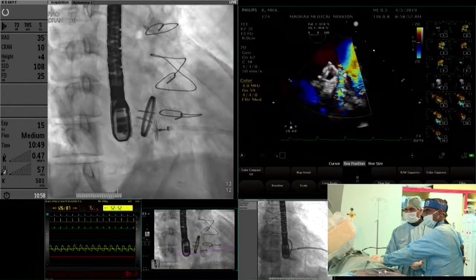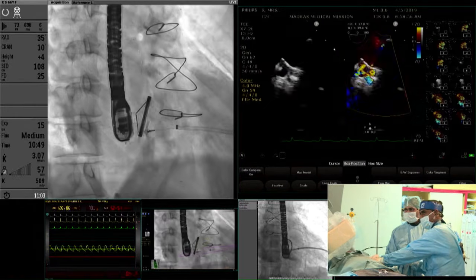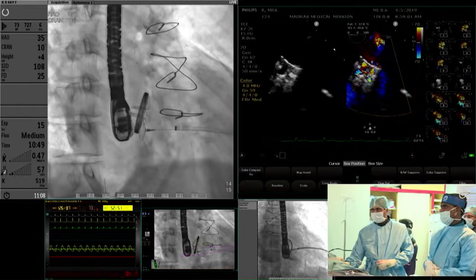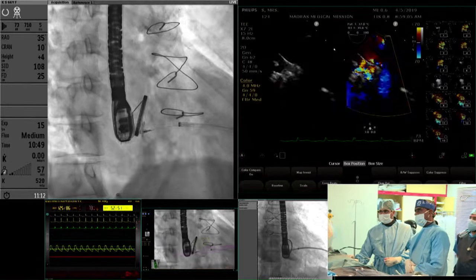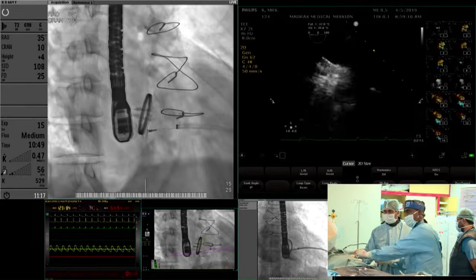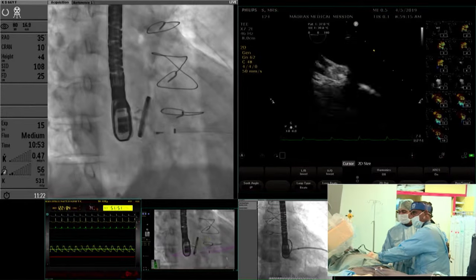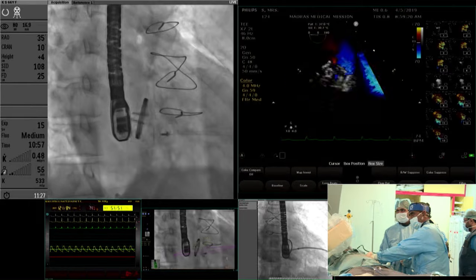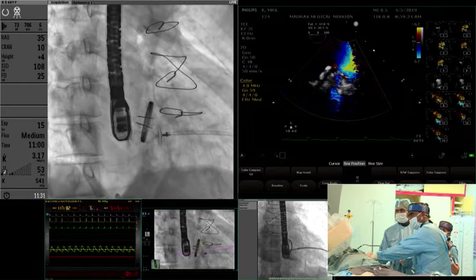Now, the position looks satisfactory for me. No, actually it is slipping out. Even if it slips out, Srija, if the leak has settled to 60, then I am okay. Dr. Sivakumar, how are you adjusting the device to get it in the center? Are you pulling and pushing? Yeah, I'm pulling and pushing. However, you see that this particular leak was possibly a little larger, and so it is milking it out. See, I'm getting it in the center. Can you see that? However, it is not staying there.